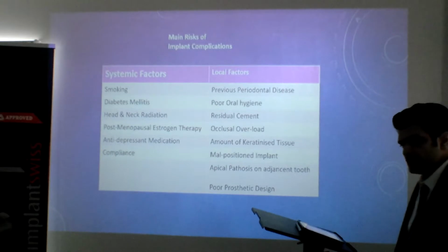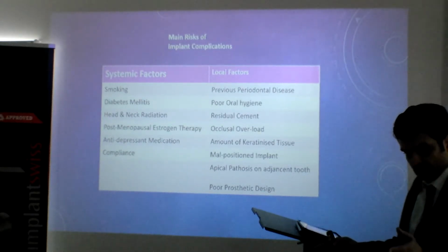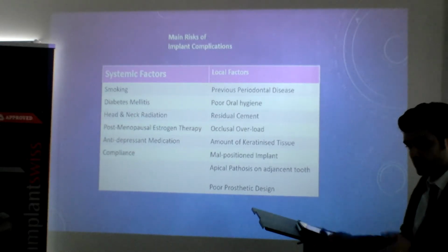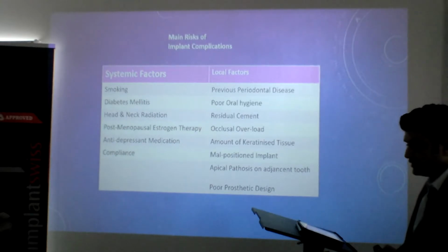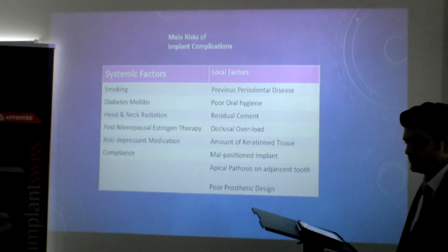So some things that we just kind of revise now. You should have some bone width. You have to keep in mind that you've got 2 mm of bone available on either side of an implant, and your soft tissue as well. If the total thickness is just 2 mm, how big an implant will you place there? You can't, isn't it? So what do you think? You need at least 8 mm to put a 4 mm implant and 2 and 2 on either side.